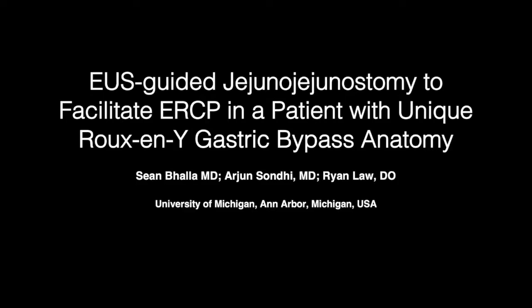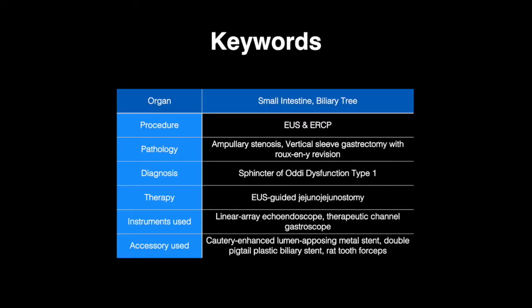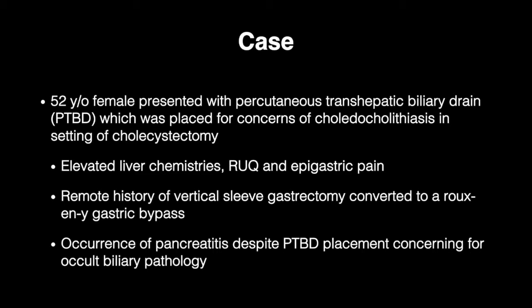EUS-guided jejuno-jejunostomy to facilitate ERCP in a patient with unique Roux-en-Y gastric bypass anatomy. Our patient was a 52-year-old female who presented with an indwelling percutaneous transhepatic biliary drain, which was placed for concern of choledocholithiasis in the setting of prior cholecystectomy.